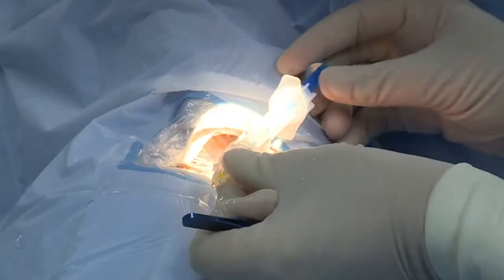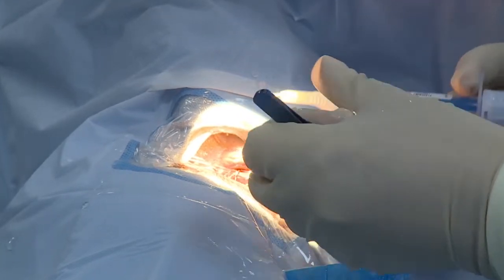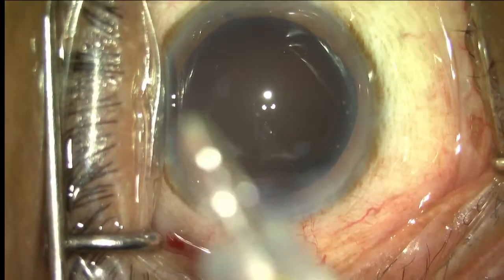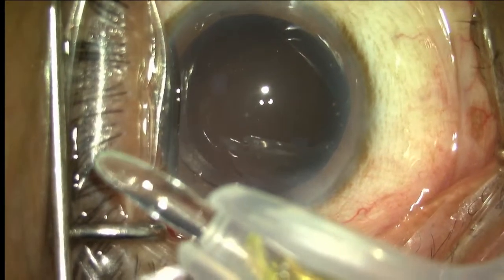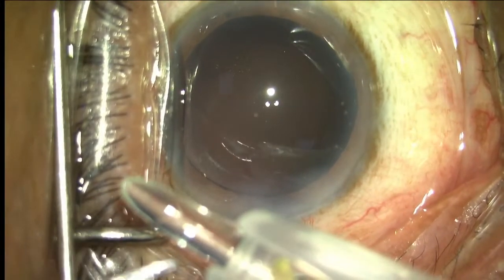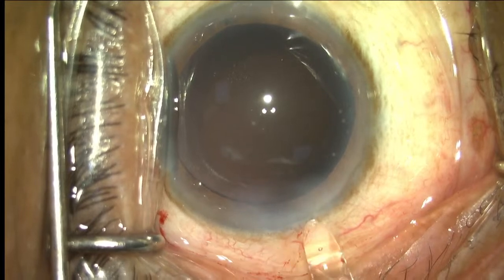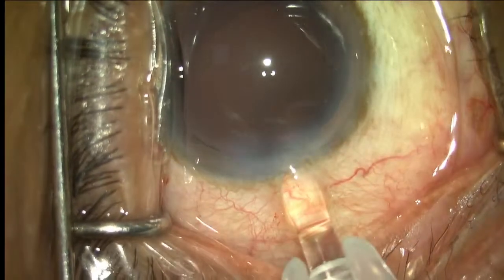This 2.2 is there. So the use of this injector is very easy, and I think it's one of the best injectors I've ever used because it's quite surgeon and wound friendly. It is compatible with 2.2 millimeter incisions. So the width of the injector here is 2.2, and the width of this nozzle is 1.7. So it is quite easy to implant, and there's absolutely no distortion of the wound.